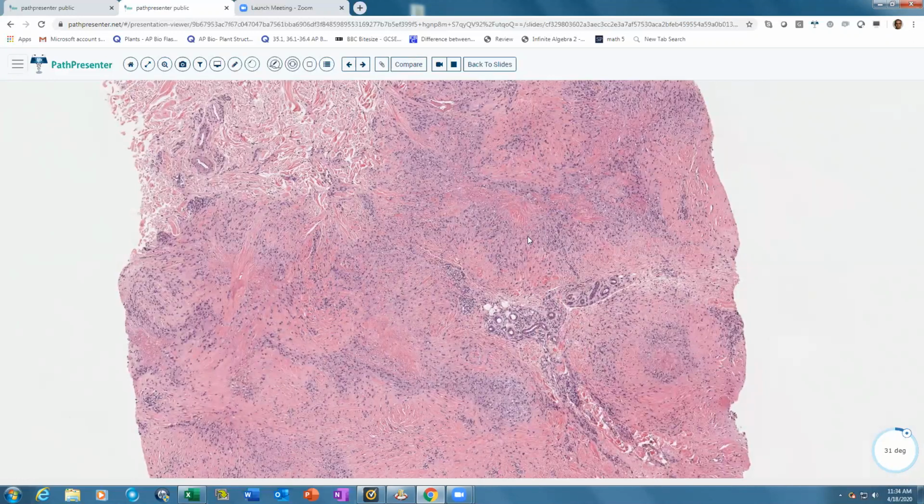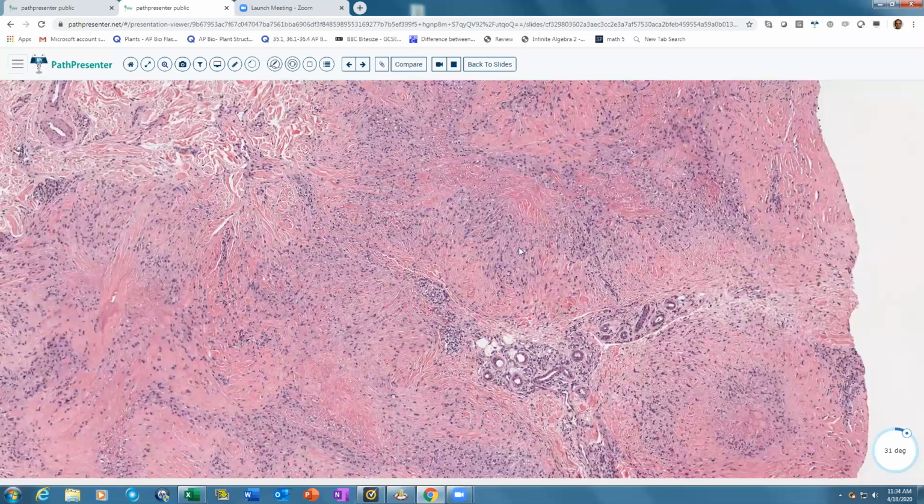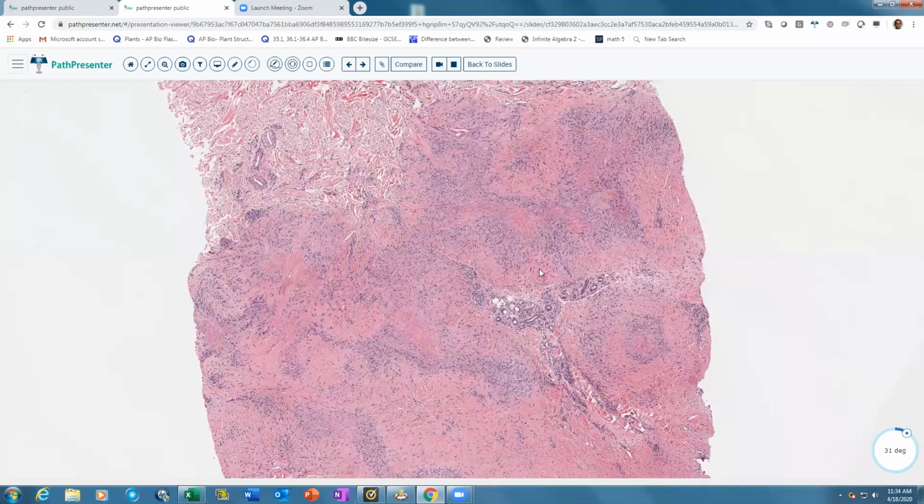This is also forming a fence. So this palisade is usually composed of lymphocytes and macrophages. And whenever you see this, this is called palisaded granulomas. And when we talk about palisaded granulomas, your list of differential diagnosis includes granuloma annulare, NLD, which we talked about, the necrobiosis lipoidica, the third one is rheumatoid nodule, and the fourth one is necrobiotic xanthogranuloma. So these four will present with palisaded granulomas. So when you see this palisaded granuloma, you know that you are dealing with one of these four diagnoses.